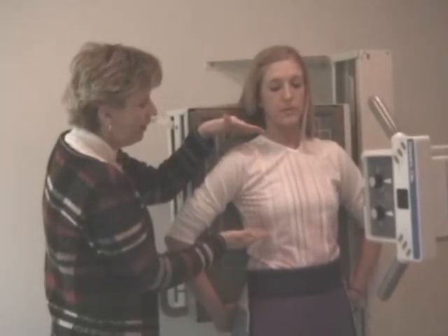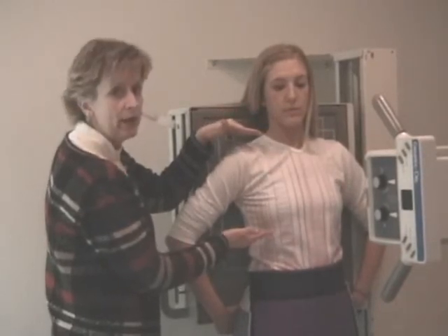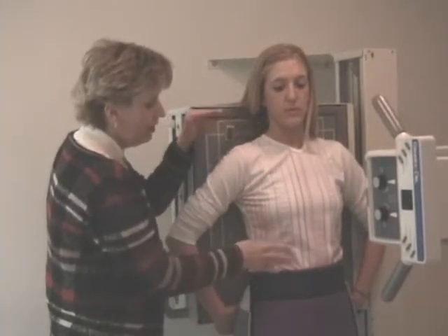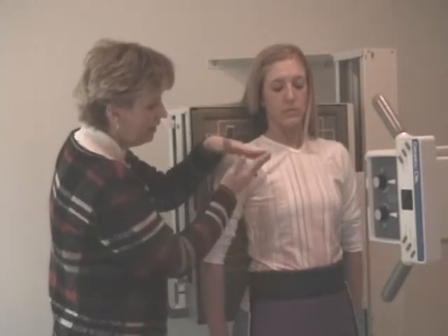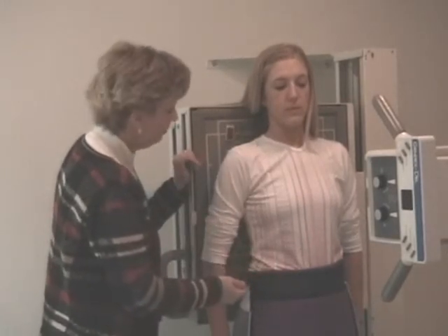Anything in the lung area above the diaphragm is going to be air, and it will be easily penetrated. So these ribs will be all of the same density, and anything below the diaphragm is going to be light compared to the lungs. So we want to drop the diaphragm down to get as many of the lungs as possible in a same density mode.